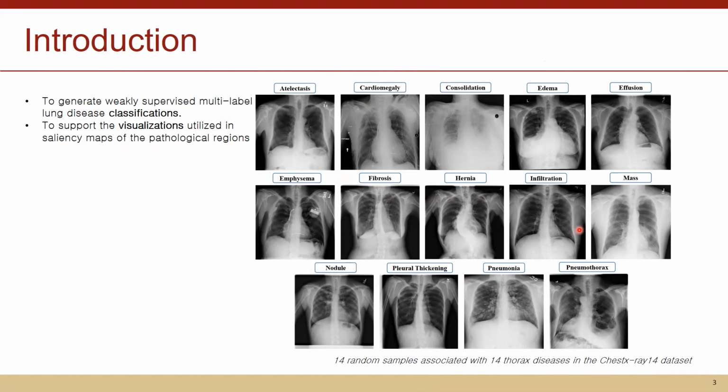Our motivation to build the model is to perform weakly supervised multi-label lung disease classification, and also to support the visualization of the lung region or the disease region. We are trying to combine CAM or saliency maps to visualize those highlighted regions.